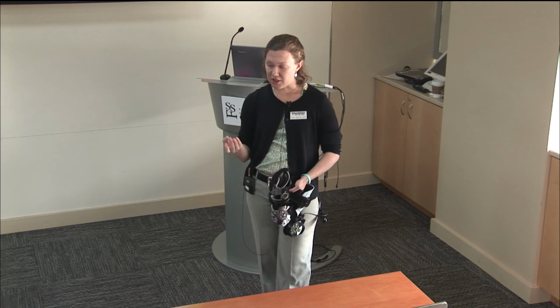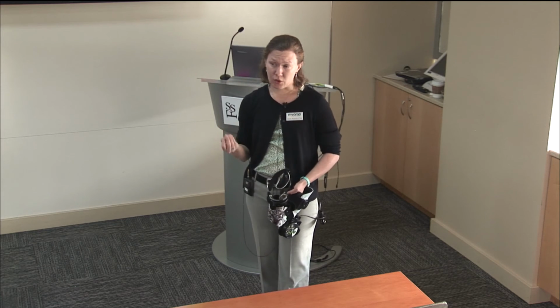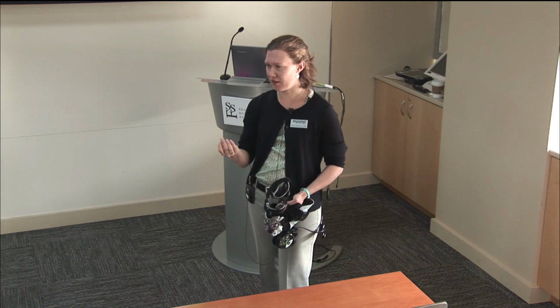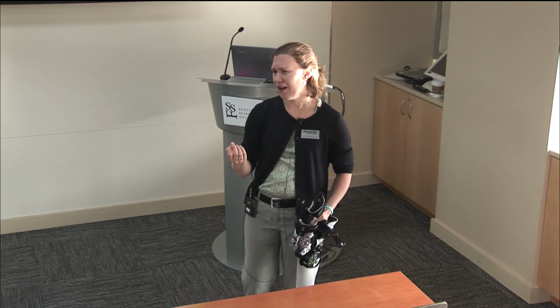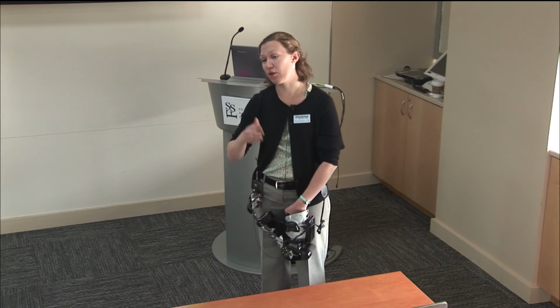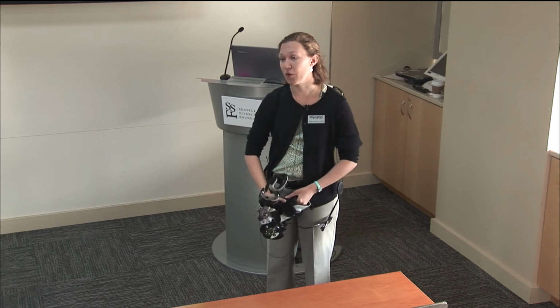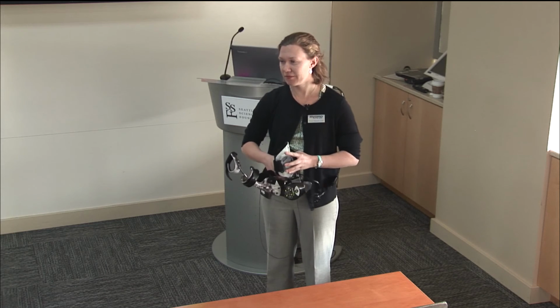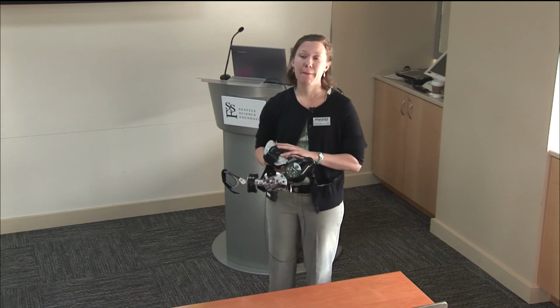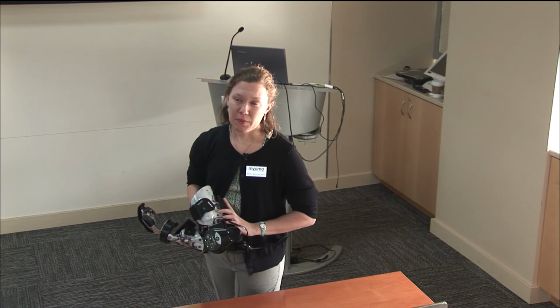And then in addition to that, we do have some OTs who are running their own diagnostic outcomes as well, box and blocks tests and things of that nature. We internally also run a program called the National Outcomes Database, where we check in with users every 3 months to determine what sorts of activities they are doing with their orthosis. Is the elbow extension strong enough to provide weight shifting when you're giving the electrical stimulation?